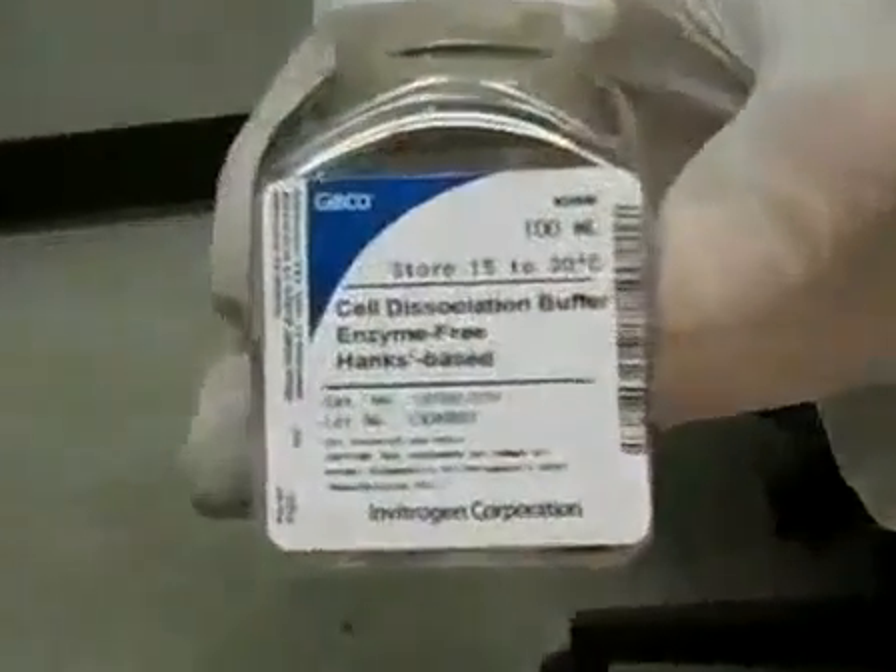It's important to use a cell dissociation buffer when passaging cells because it's non-enzymatic, unlike trypsin, and it's much gentler on cells.